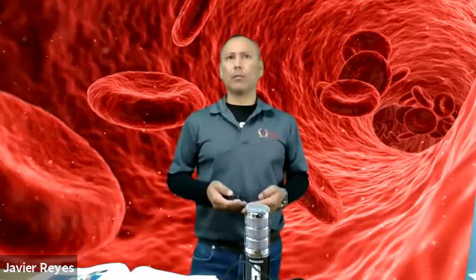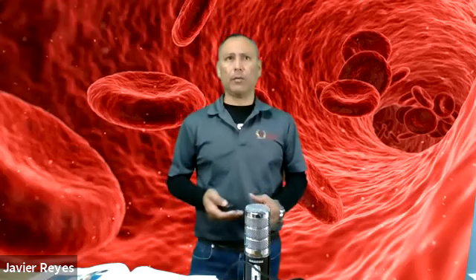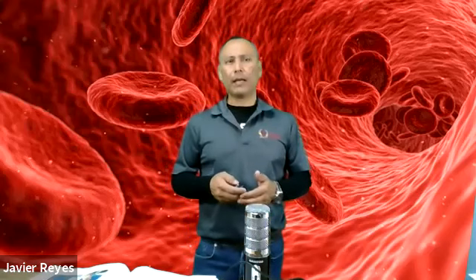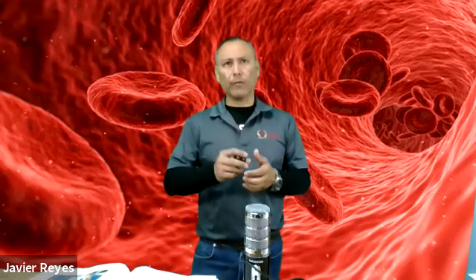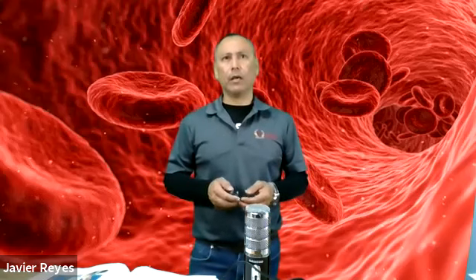Okay, so capillary blood collection tubes have several parts to that equipment. Okay, it comes in a kit. So capillary blood gases include the narrow bore plastic capillary tubes, which are very small, a stirrer which goes inside the tube, a magnet that is used to move the stirrer back and forth, okay, and plastic caps, obviously to seal the collection tubes. So all that is the equipment.